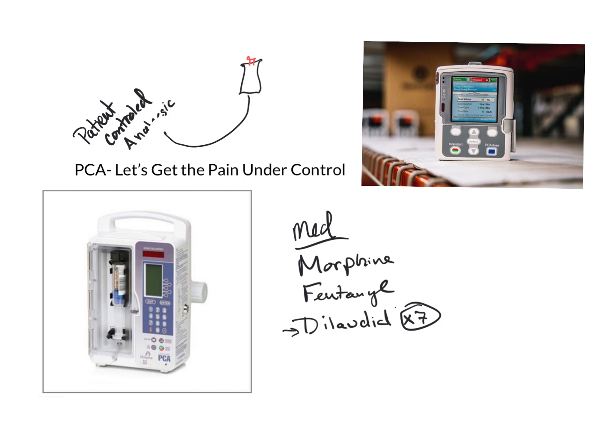Here's the thing, we don't order that, the doctors do, but we can be the advocate for the patient and the family. Here are 2 examples of pumps. You have this one that I see frequently used at hospitals. It's PCA. It's really big and blocky. This looks like probably 30 ml of morphine in it, which is a 30 milligram dose of morphine, so it's a 1-to-1 concentration. Not a big deal for you to know, that'll all be in the orders, but important to know that this is a really big thing.